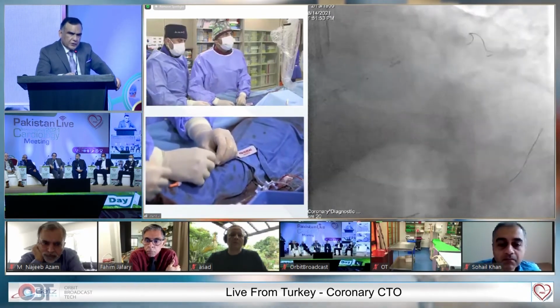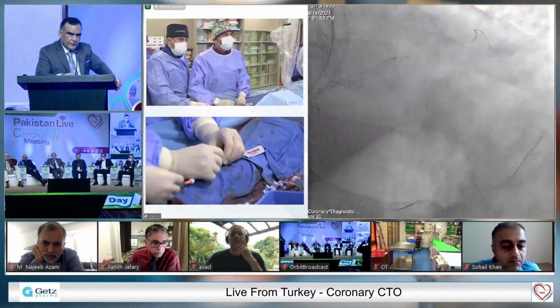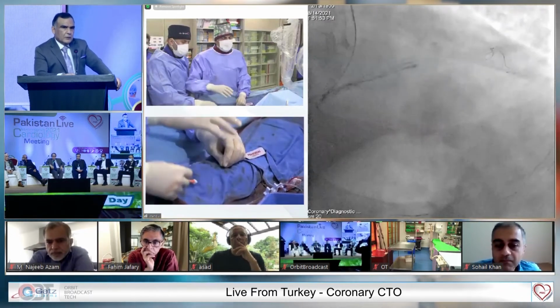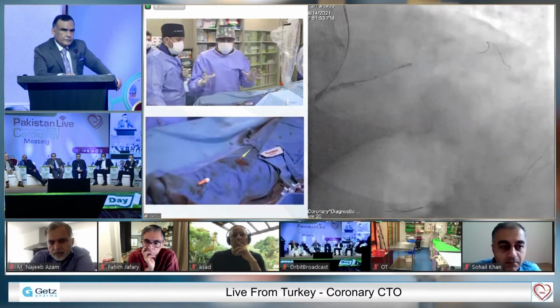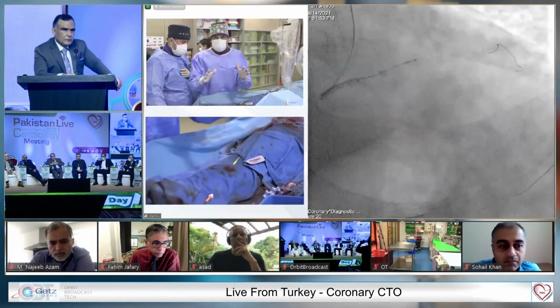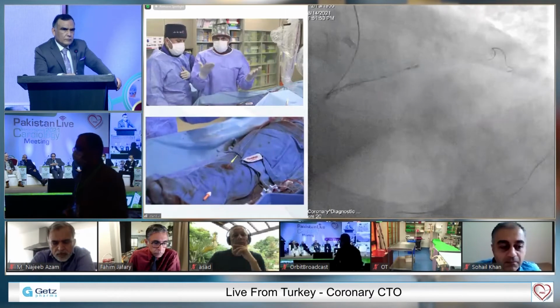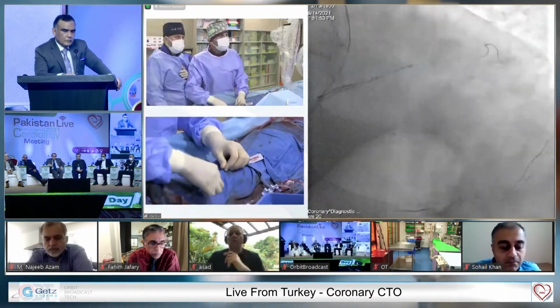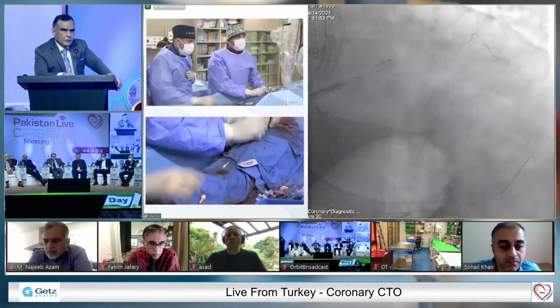One of the panelists is asking Gaia 2, or why not Gaia 3? Why not Gaia? You know why? Because I see some side branch there. When you have a side branch, it's nice to use a wire to penetrate easily. Otherwise, it may slip easily into the side branch. That's the thing. But you can use Gaia 2nd, Gaia 3rd for the start. It's possible, of course.